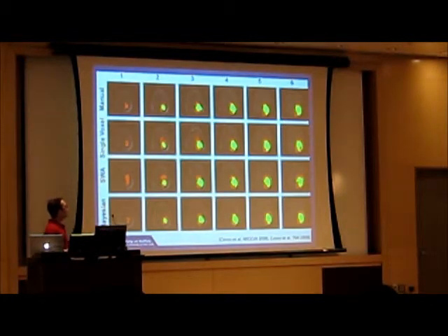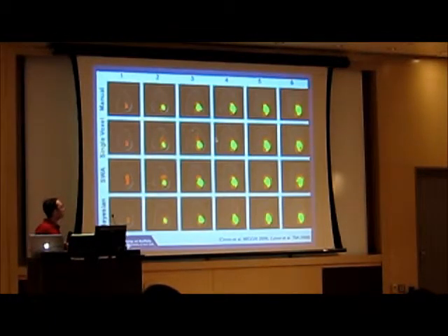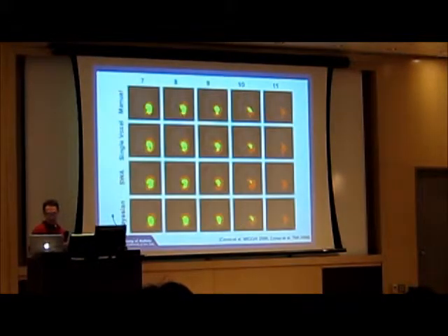Okay. And if you look at more classifications against human labels, against manual expert radiologists doing the labels, the second row here is just a max likelihood at each classifier, each pixel. Original SWA, Bayesian SWA. Largely, these two lower levels are similar, but it's only in the details, I guess you might say, of the regions that you get to see the quite differences. Things like this guy here.